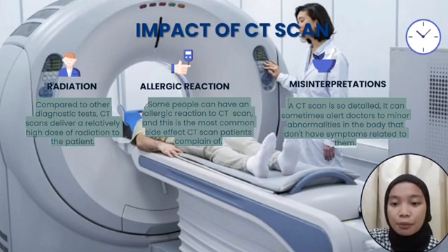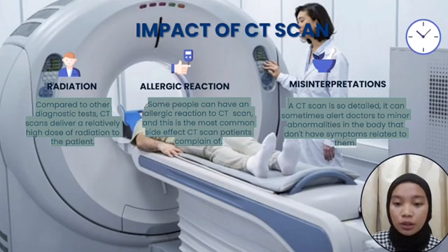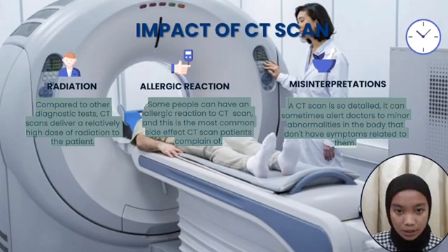So the last one is misinterpretations. Because CT scan is so detailed, it can sometimes alert doctors to minor abnormalities in the body that don't have symptoms related to them, and in the normal course of life would not have caused the patient any problems. However, doctors may feel the obligation to divulge this information to patients, which can cause anxiety and possible unnecessary follow-up tests or treatments.